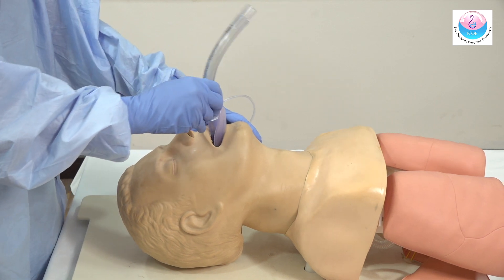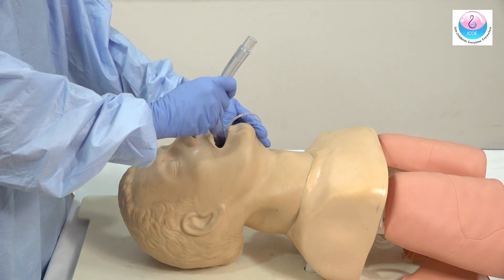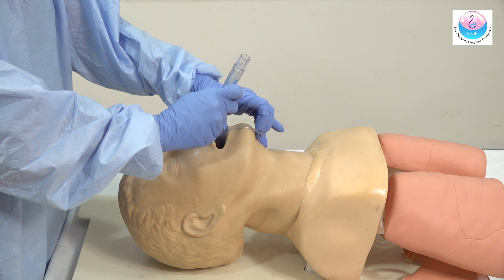Flex the neck, lift the chin, and glide the mask with the lubricated posterior aspect along the palate. The marking will ensure correct depth. Inflate the cuff.